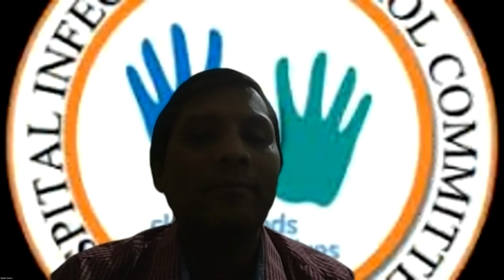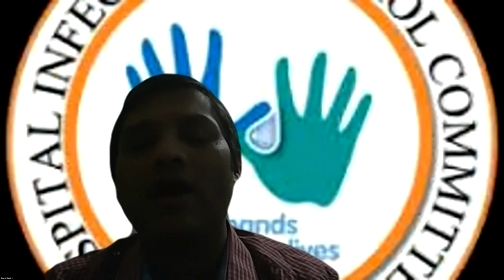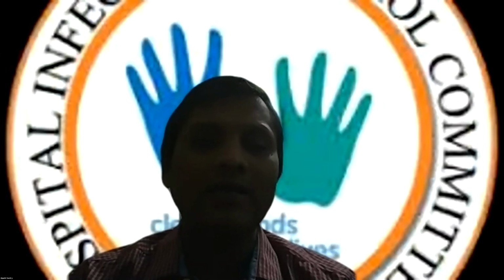This strategy we started when Dipasri was there as a senior resident, maybe in 2017, and in the last 5 years we have seen that there is a dramatic change in the outcome of the patients. There are errors among DST and AST, but the errors are very limited, and it is quite safe. And now both CLSI and EUCAST have recommended using direct susceptibility test. Therefore, you now have evidence that you can go ahead with direct susceptibility test.